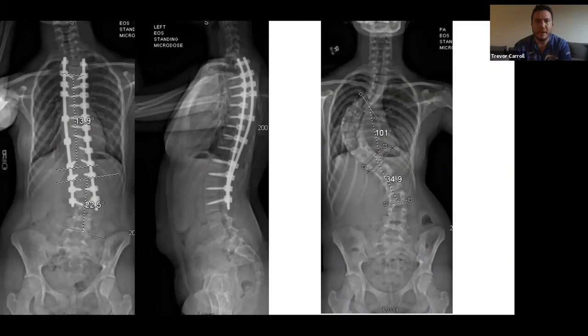All right, that's what I have. Trevor, any tips or tricks for other fellows trying to do this on their own, or thoughts about it? Anything you find strictly challenging? Go slow. I like that plan. I like being cautious as you're placing screws. It really is dependent upon great screw placement. We place all our screws freehand, so you get a real sense about how that cancellous bone feels.